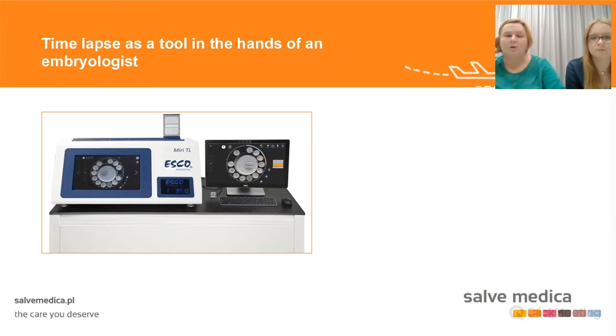Example device, incubator with built-in camera with software to collect a lot of data during culturing embryo.